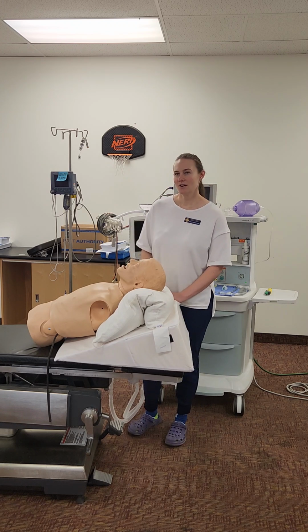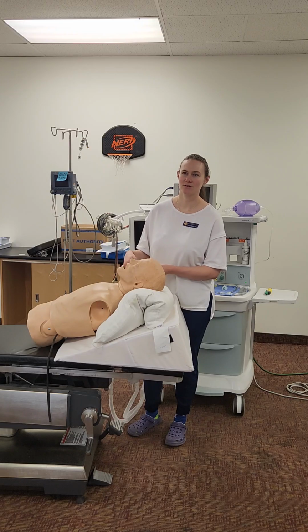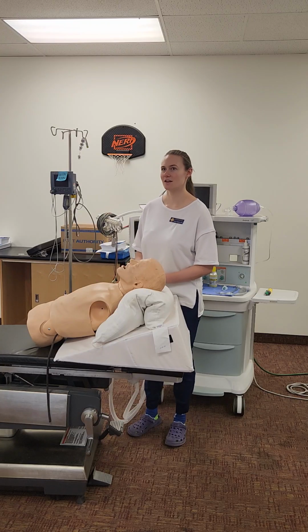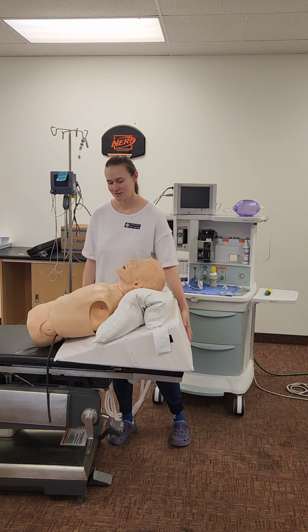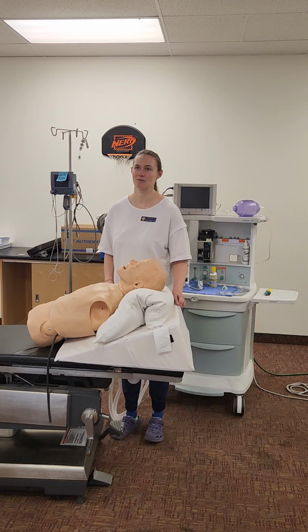Now we'll ask him to scoot over to the bed. Now we're in the cold OR, so we'll put a warm blanket over him. After he scoots over to the bed, we'll put on the pulse ox, the blood pressure, and the EKG stickers, and then I'll explain that this ramping is because you're a potentially difficult airway. I just need to give myself the best chance that there is to intubate you on the first try, the least painful way possible for both of us.